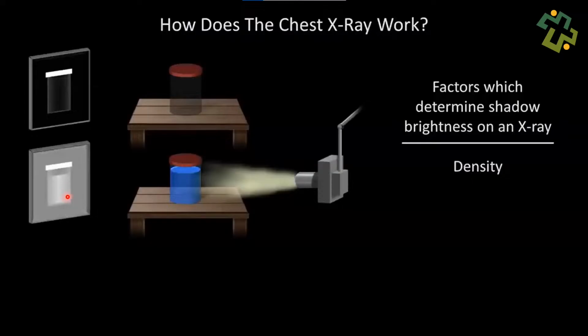It is important to realize that even if the fluid in the jar is completely 100% transparent, as is water, it will still block X-rays and therefore still appear gray. Now, the fraction of X-rays a substance blocks has absolutely nothing to do with its color or degree of translucency within the visible light spectrum.